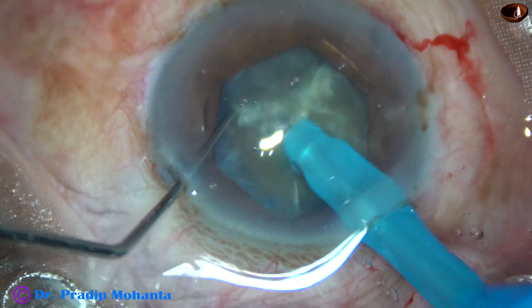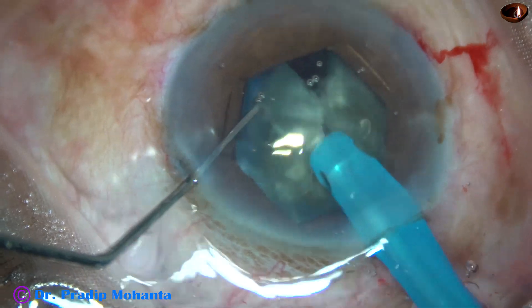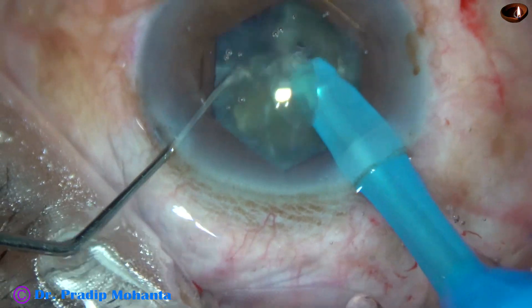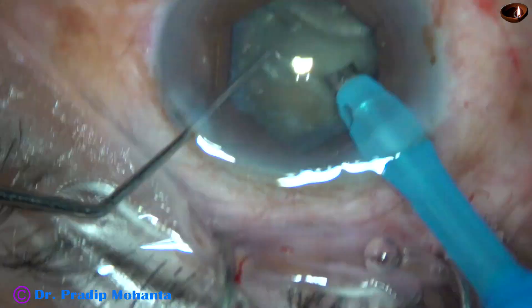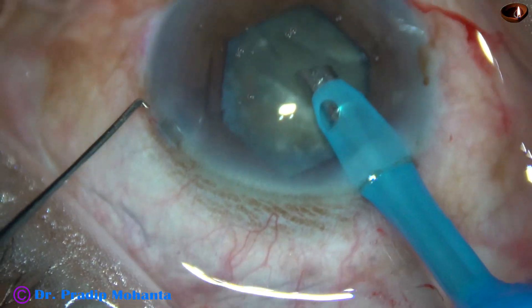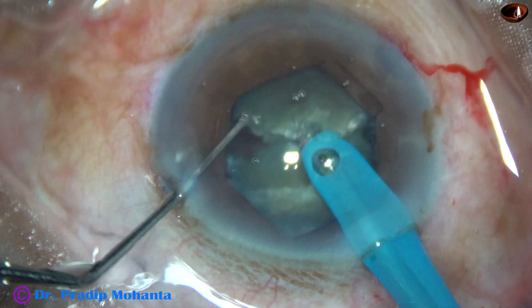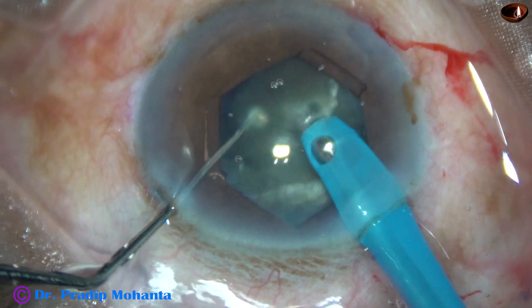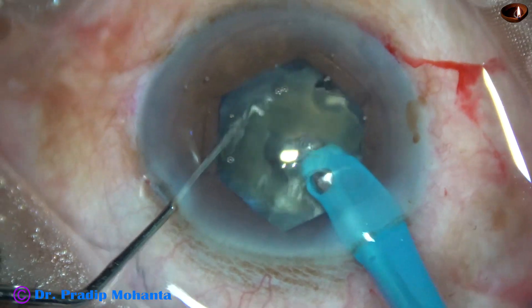The free nuclear fragment is removed to make some room for the rest of the nucleus for easy movement. This smaller portion is then chopped and emulsified.